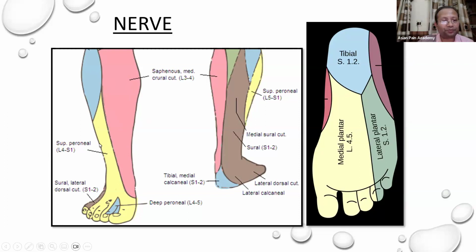Then comes one nerve. Two is okay. On the lateral side, 2 nerves. So what are they supplying? Since the peroneal nerve is on the lateral side, the branch of the superficial peroneal nerve is also on the lateral side. And there is another nerve, the sural nerve.